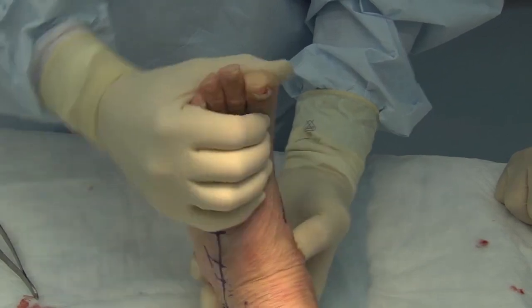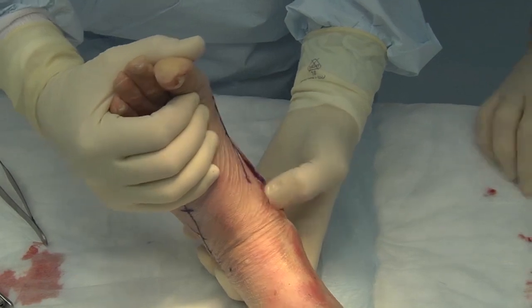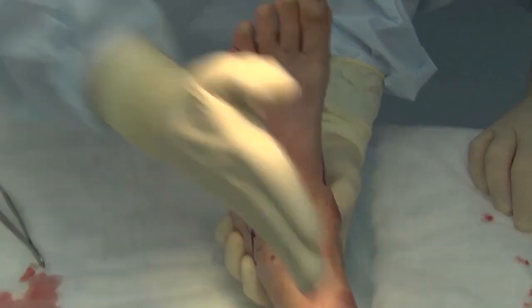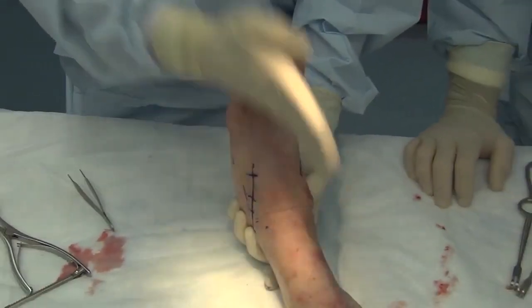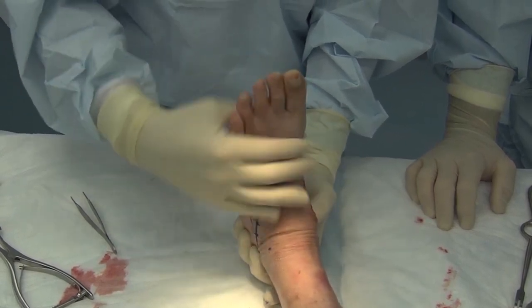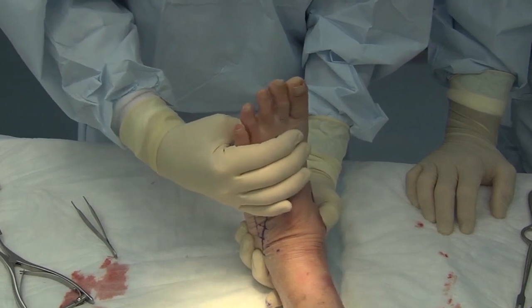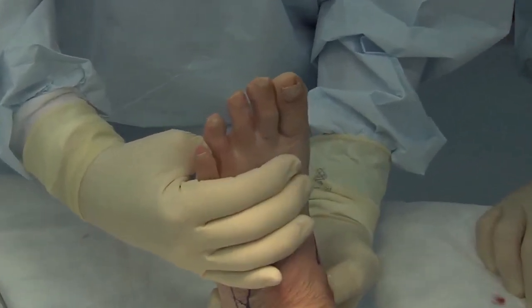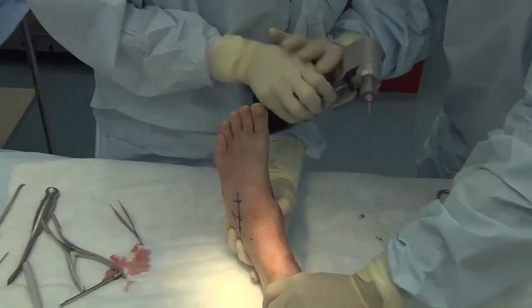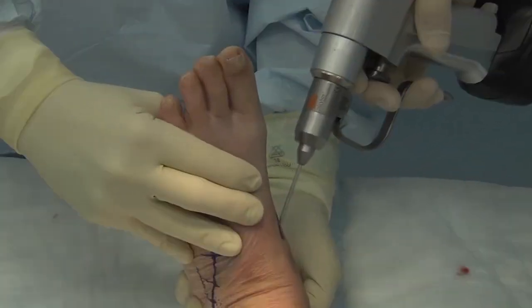I'm holding the hindfoot with my hand and I'm controlling the position of the talonavicular joint, feeling that reduction with my thumb — all the while looking at the tibial tubercle and the relationship to the forefoot. The goal is that I want the second toe lined up to the tibial tubercle. I like what I see; the reduction feels good. And I will have my assistant or my resident put a K-wire in there and hold that joint in position.